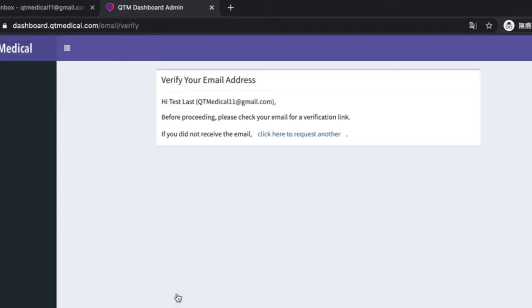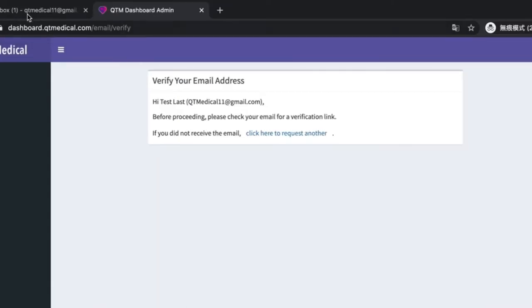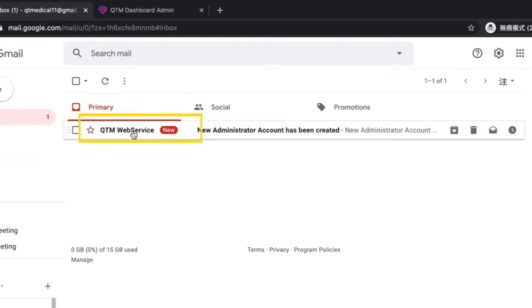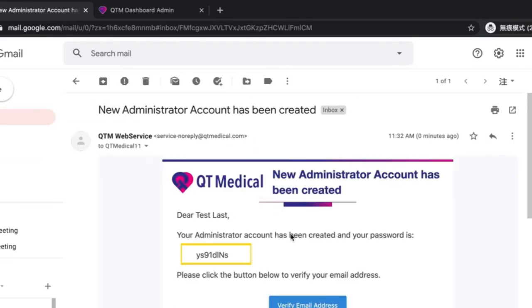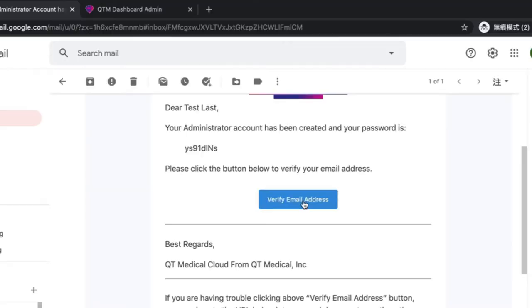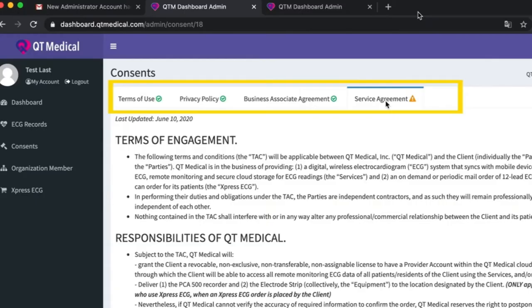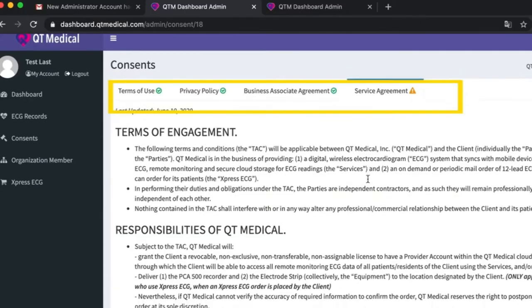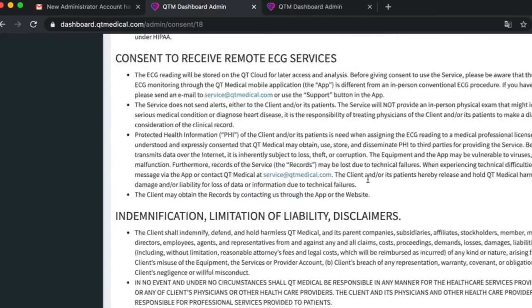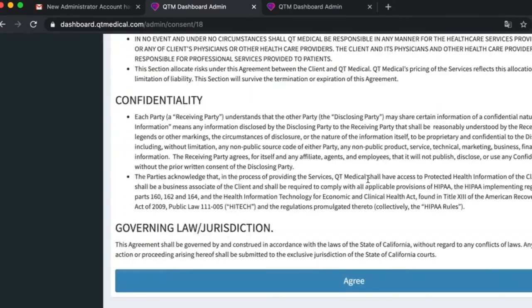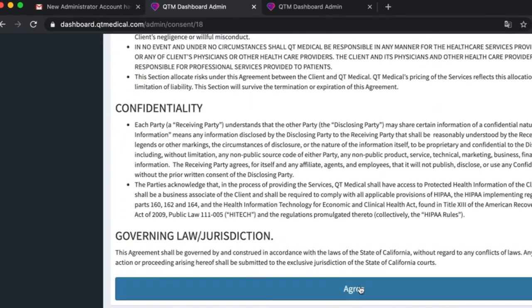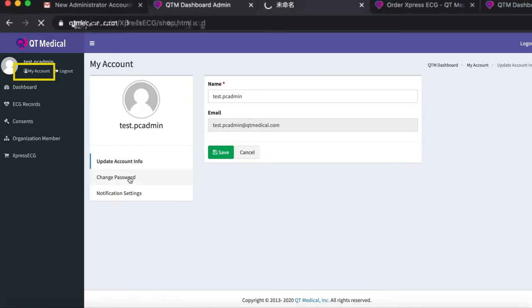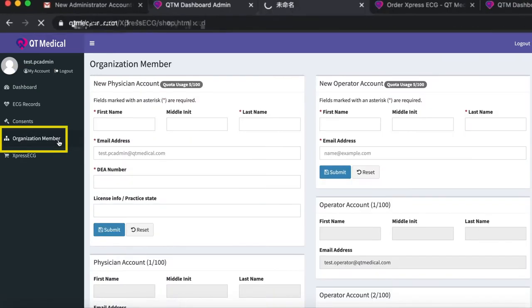The email contains a link for email verification and a temporary password. Click the activate link in the email. Browse through the privacy policy, business associate agreement, terms of use, and service agreement. Accept the agreements. Go to my account to change your password. This is your administrator account.